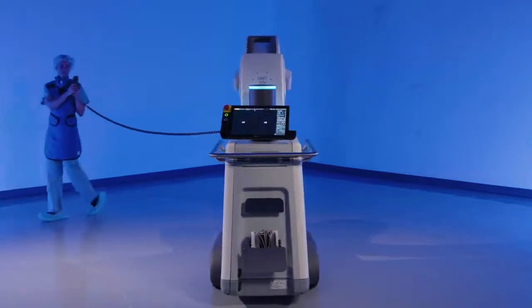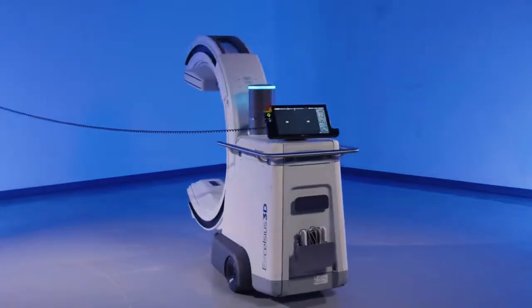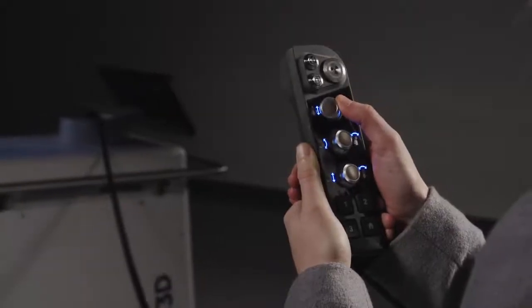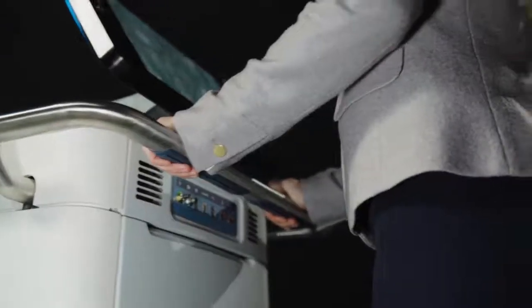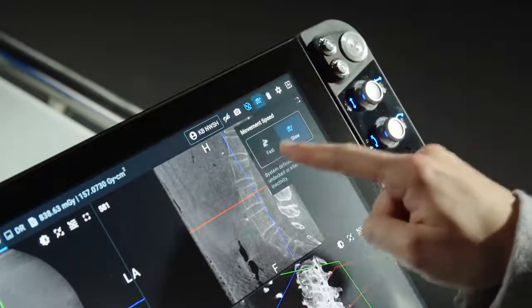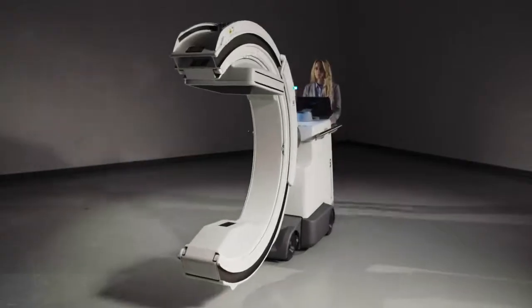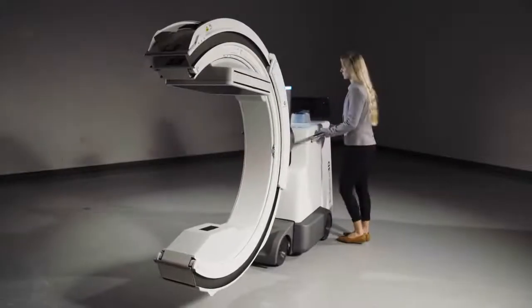Omnidirectional motion can easily be controlled by the handheld controller's three joysticks or the haptic response handle. There are two travel speeds, fast and slow, allowing users to limit the speed when moving about the patient in comparison to the hallway.